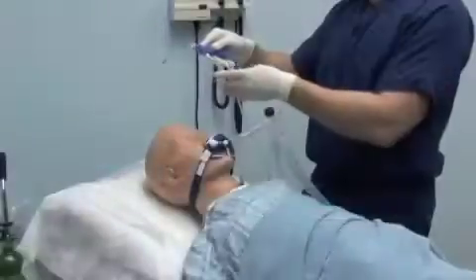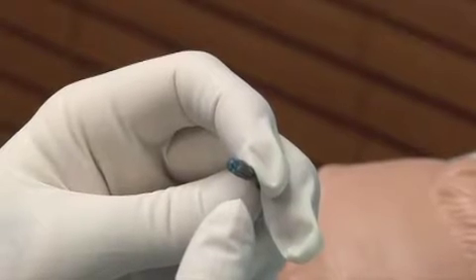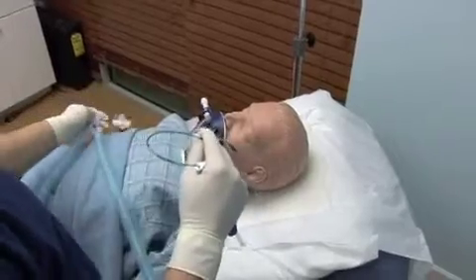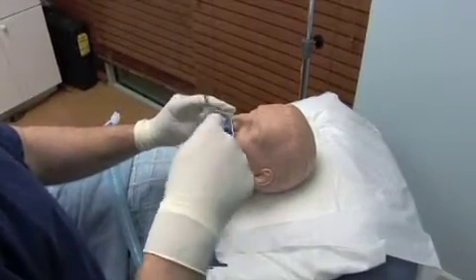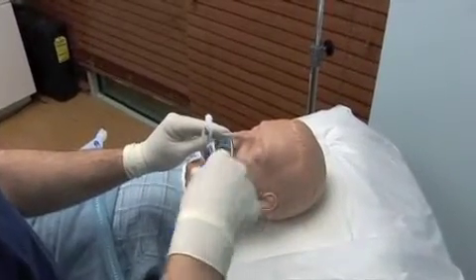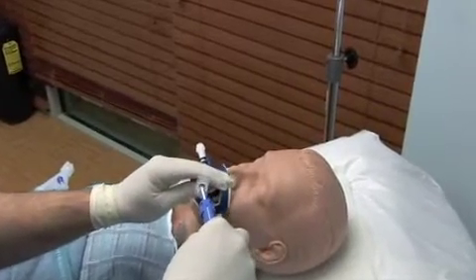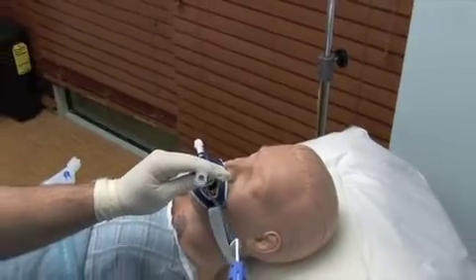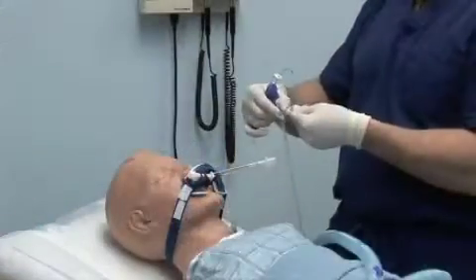Connect suction tubing to the suction port and apply vacuum at the clinically indicated level. Disconnect the ventilator tubing from the endotracheal tube and advance the catheter into the endotracheal tube to the preset depth. Stabilize the endotracheal tube with one hand; with the other hand, withdraw the catheter completely from the endotracheal tube. Reconnect the ventilator circuit tubing to the endotracheal tube.